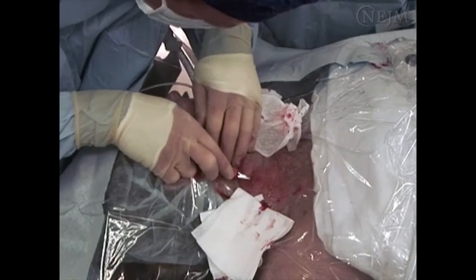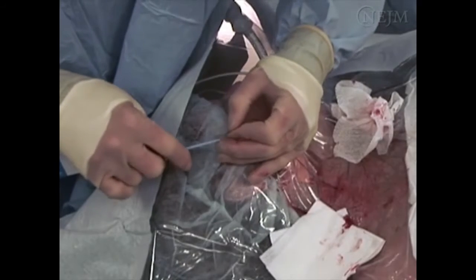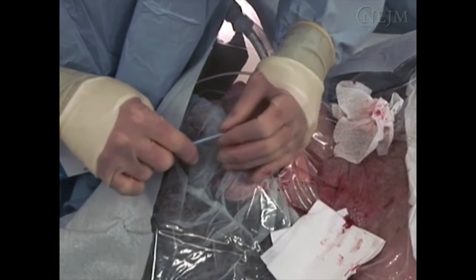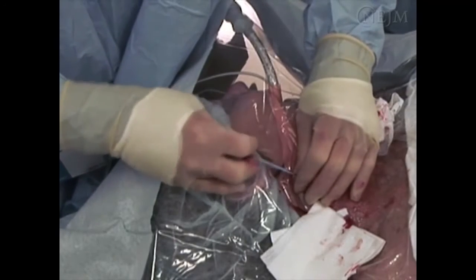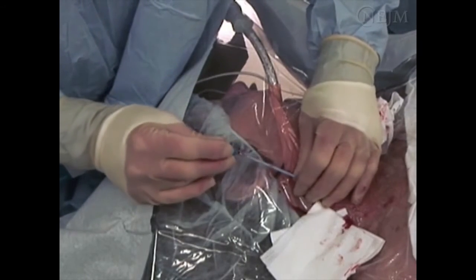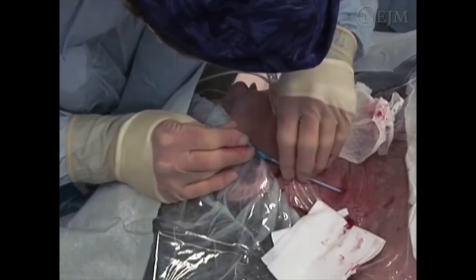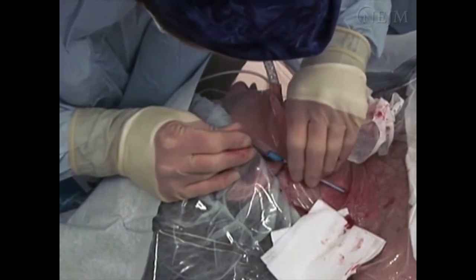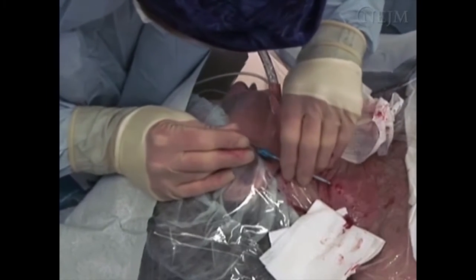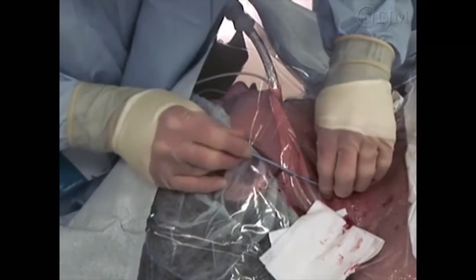Using an 11-blade scalpel, make a small superficial incision at the entry point of the wire to facilitate passage of the dilator through the skin. Be careful not to cut the wire. Place the dilator over the guide wire, being certain to maintain control of the wire at all times in order to prevent a wire embolism, and advance the dilator 1 to 2 centimeters by holding it close to the tip and rotating it. Be careful not to introduce a bend or kink in the guide wire.